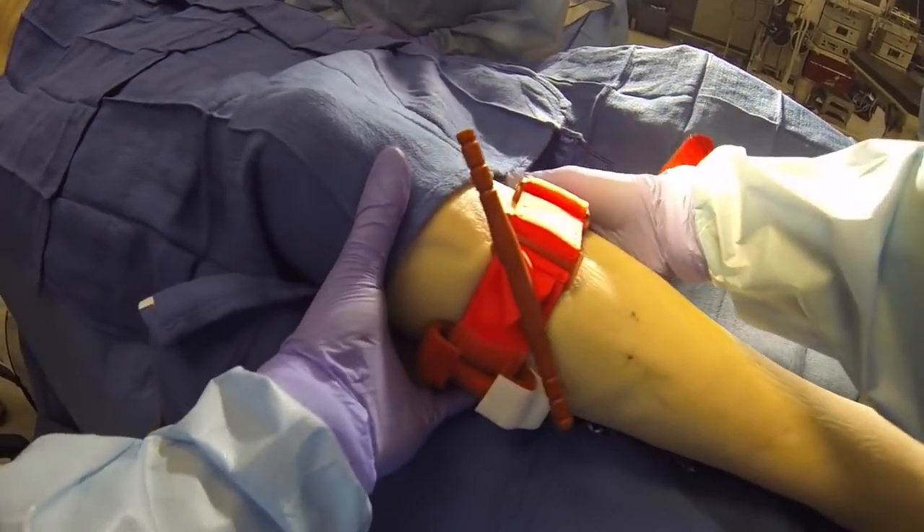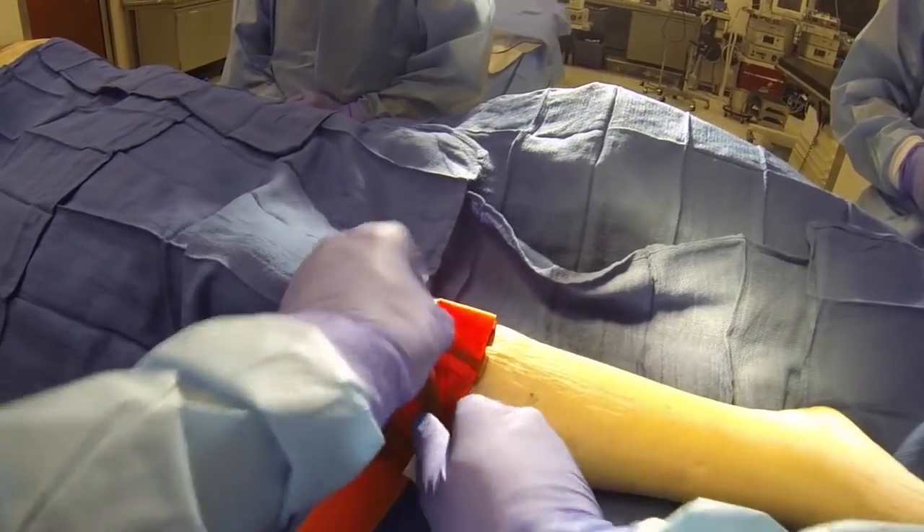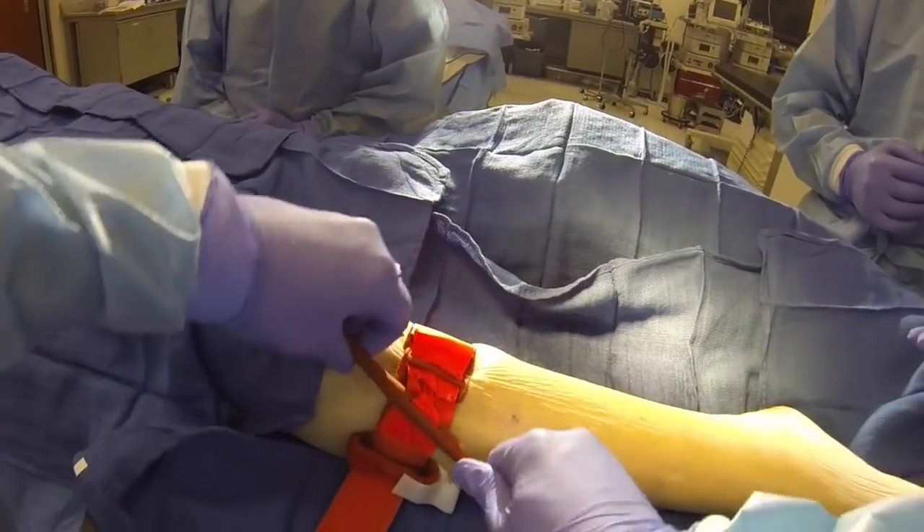As you would be applying a tourniquet to a leg site, always make sure the buckle is doubled back, and as is usual for any tourniquet, make sure that you are recording an accurate tourniquet time.